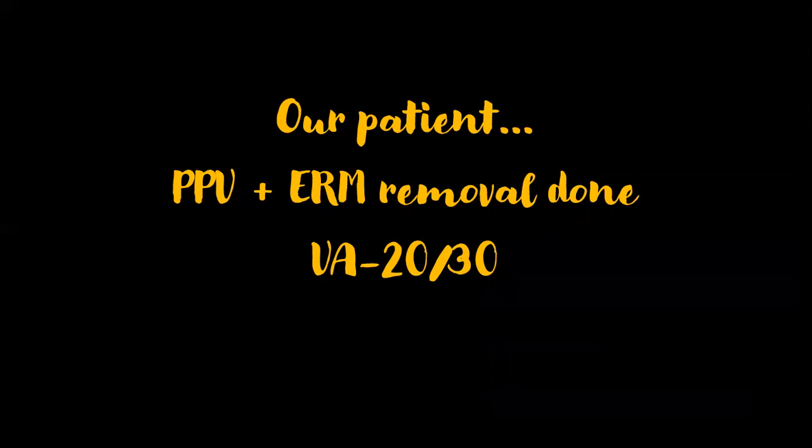In our patient, PPV plus ERM removal was done with subsequent visual acuity improvement to 20/30. The macula was completely relieved of traction.